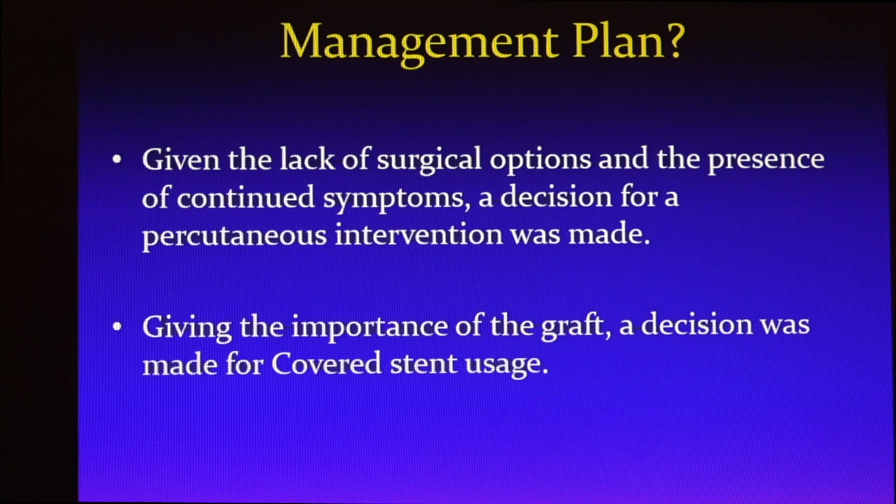So we had to find a way to keep the flow going to the right coronary territory without any flow going to the right atrium. The only option was a covered stent. The aneurysm, as you noticed earlier, is really big for a coronary covered stent, so we felt the only option we could use here was Viabahn covered stents.